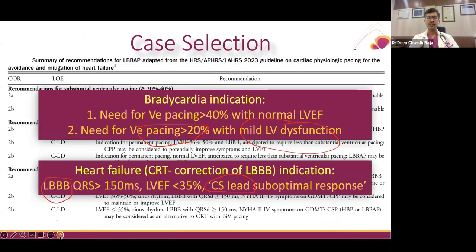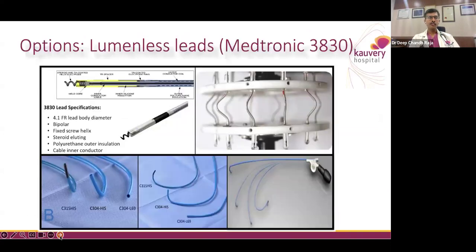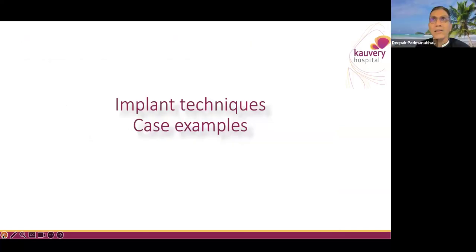We'll be discussing all these indications and the implant techniques. One thing before we move ahead: I would like our listeners to appreciate the fact that this is still a pacing requirement.